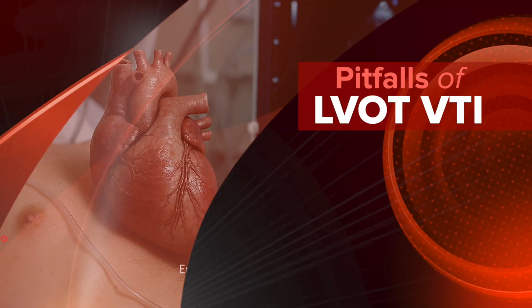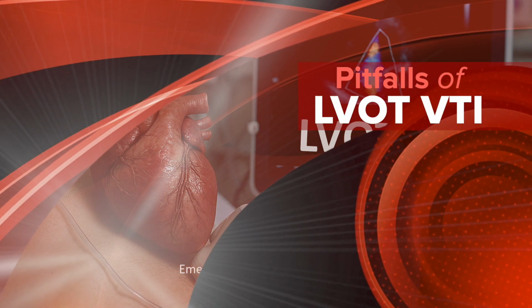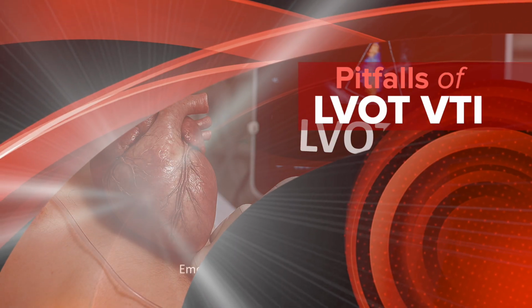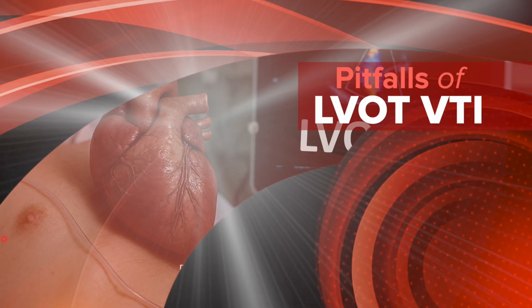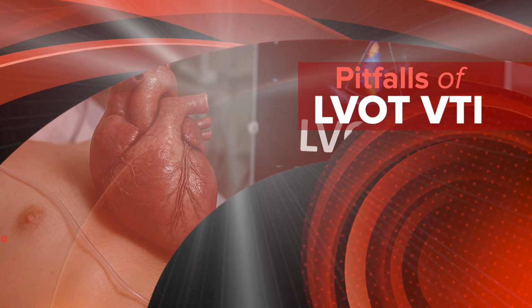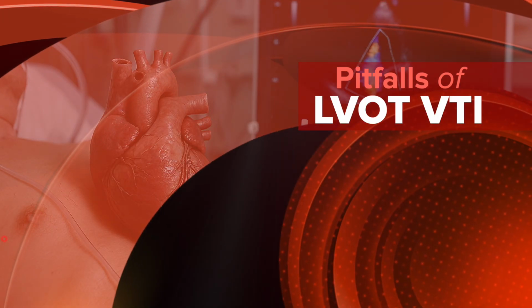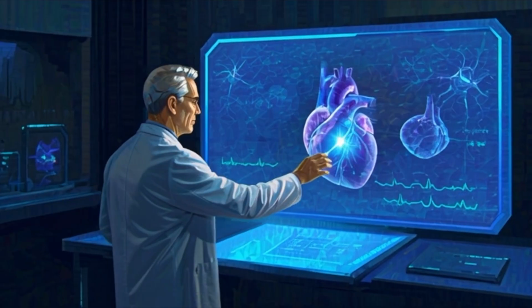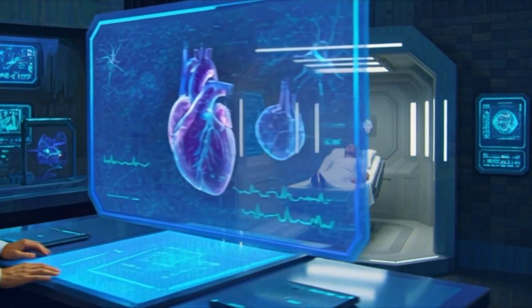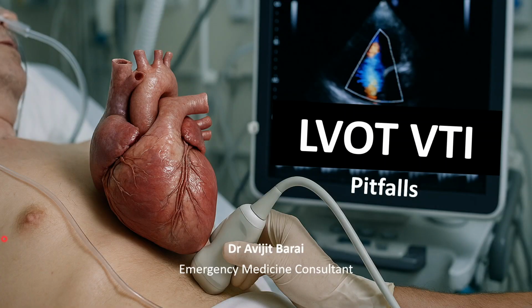Over the next few minutes, we are going to talk about the pitfalls of LVOT VTI. We use LVOT VTI all the time in critically unwell patients such as shock, heart failure, pulmonary embolism. LVOT VTI is such a useful tool. It helps us decide what is the best treatment modality for a patient. Having said that, LVOT VTI has some pitfalls or limitations that we need to be aware of so that we can make the best use of it. So without further delay, let's dive into it.